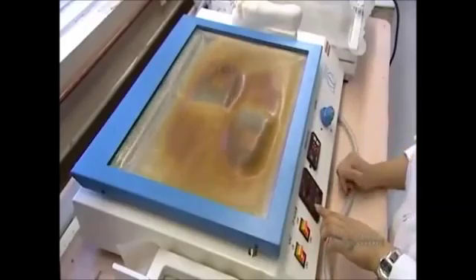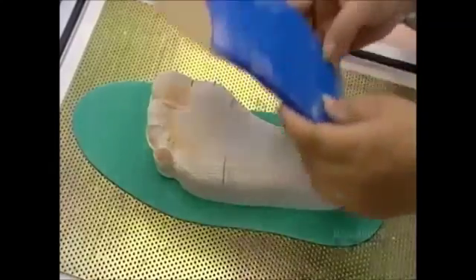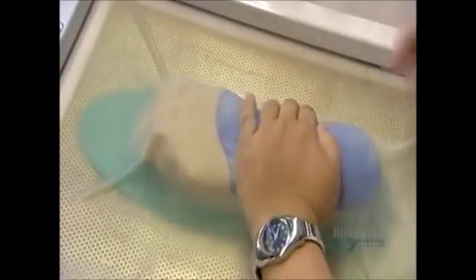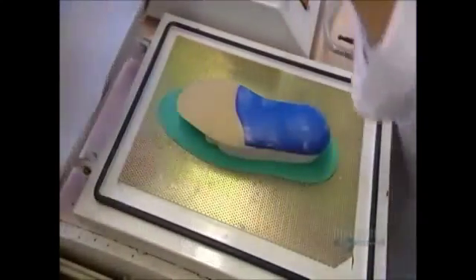They cover the assembled orthosis with a sheet of glue and put it into a vacuum press. The press applies heat to activate the adhesive. It sucks out the air between the components and compresses them tightly together. When the orthosis comes out, they place it on the model of the corresponding foot. Then it goes into a different vacuum press to mold it to the shape.